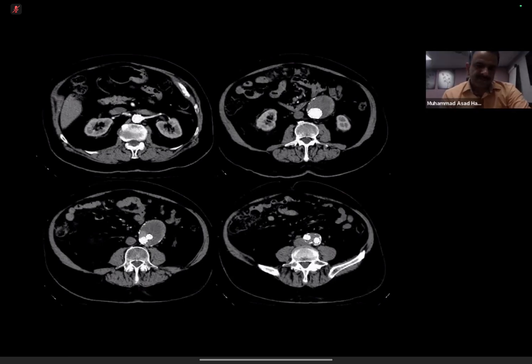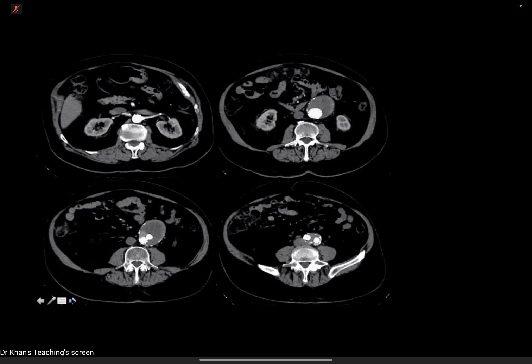Absolutely. Brilliant. So in vascular and interventional radiology, contrast ultrasound is very helpful. Contrast enhanced ultrasound can help you identify where this endoleak is actually coming from. It can at times identify the vessel as well, whether it's coming from the inferior mesenteric or one of the lumbar vessels.